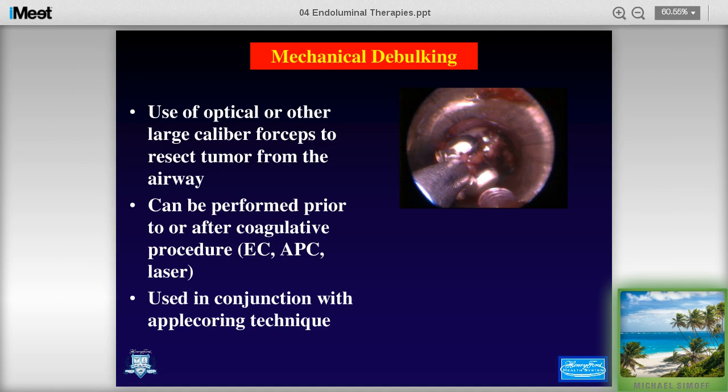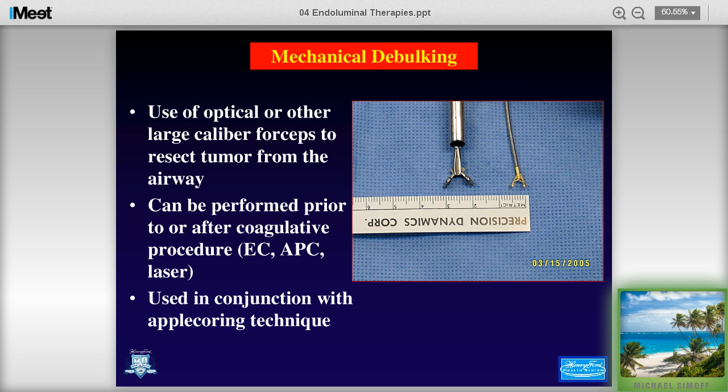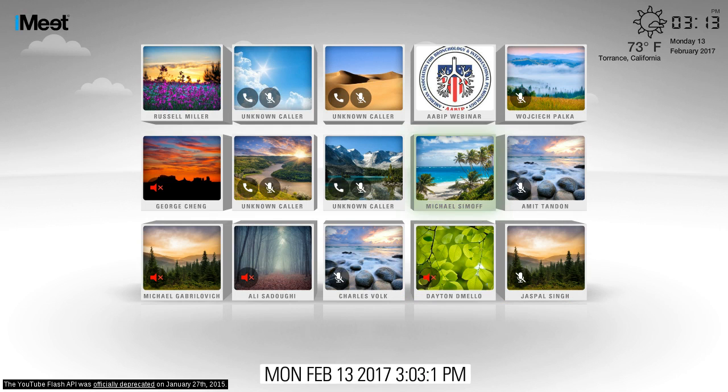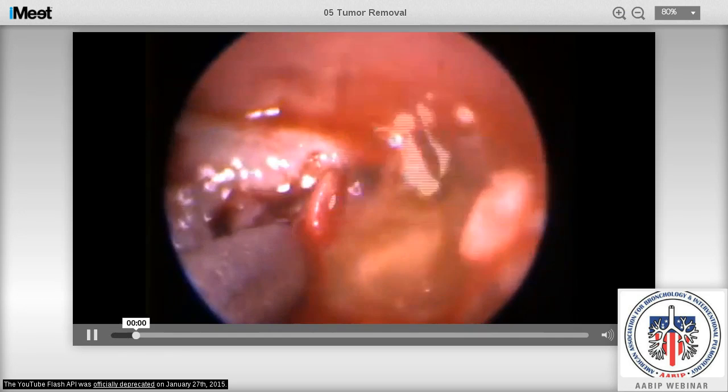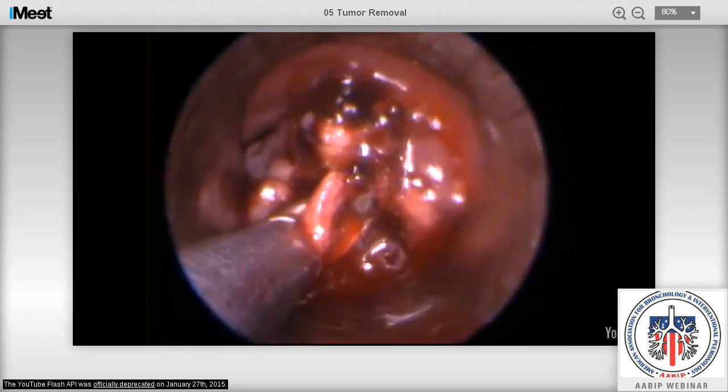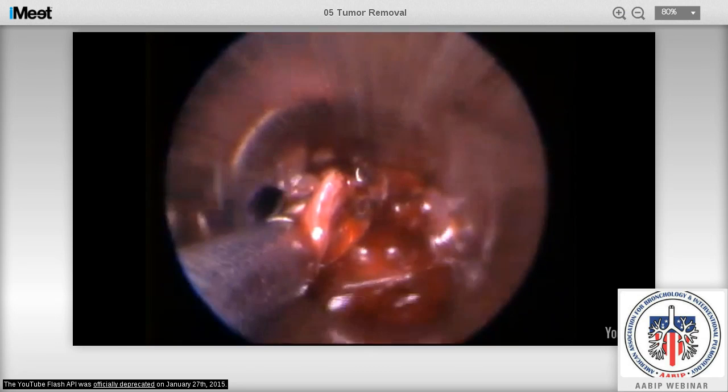After cutting out tumor, there are mechanical debulking techniques. Mechanical debulking can be used with force, with forceps, or with the rigid bronchoscope to remove large pieces of tumor. This shows rigid forceps versus flexible forceps. If you're going to debulk, flexible forceps work very well. Using rigid forceps for debulking, we can go down and grab very large pieces of tumor and pull them up through the rigid bronchoscope.